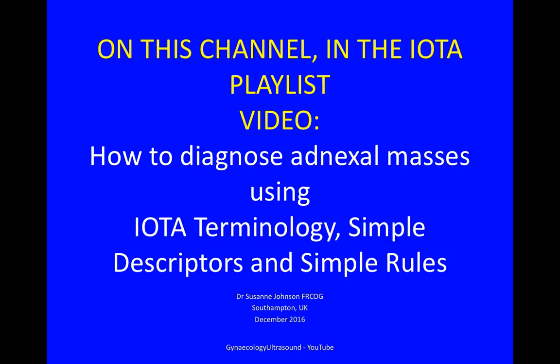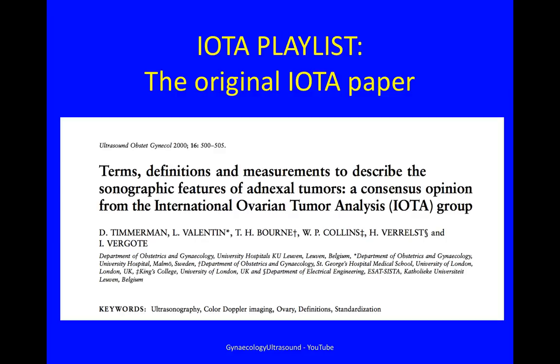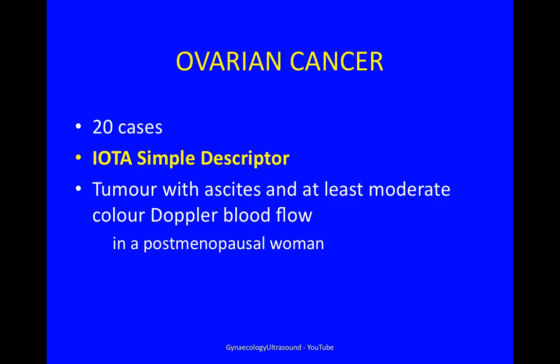On this channel, in the IOTA playlist, there's a video on how to diagnose adnexal masses, and you may want to watch this one first. There's also a video on published literature, including this, the original IOTA paper, which is essential reading. I will show you 20 cases of ovarian cancer.